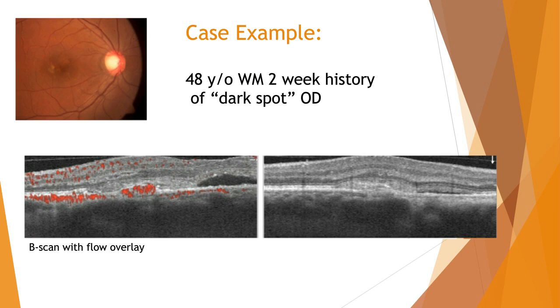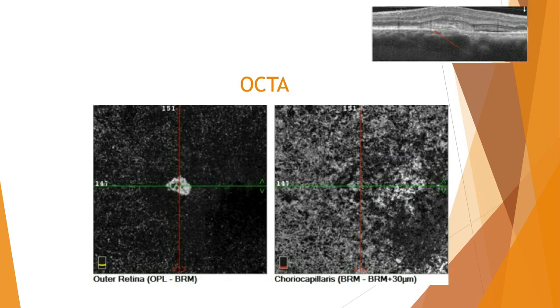Next, a classic or type 2 example: a 48-year-old white male with a dark spot in his right eye. There was no blatant CNV on the fundus photo, making the B-scan extremely useful. The B-scan shows a hyperreflective lesion with an area of serous fluid — but the lesion is above the RPE level, classifying it as a classic or type 2 pattern. The B-scan with flow overlay shows increased pixelation within that hyperreflective area, suggesting active flow. The angiogram beautifully illustrates the active membrane, which now affects both the outer retinal slab and choriocapillaris because the membrane has permeated above the RPE.